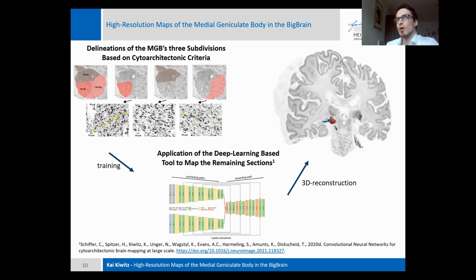So going from 2 micron to 1 micron, I would not expect it to be that much better for such a use case. But when we are talking about cellular segmentations, like Eric has talked about, then I would definitely think that the higher the resolution, the more we can benefit from the information that we can extract from that.